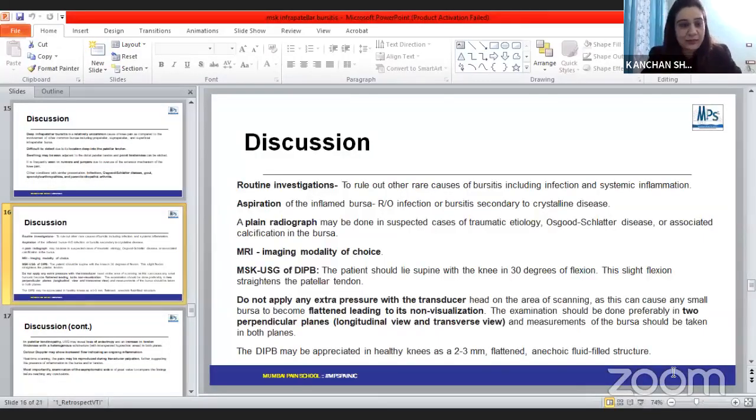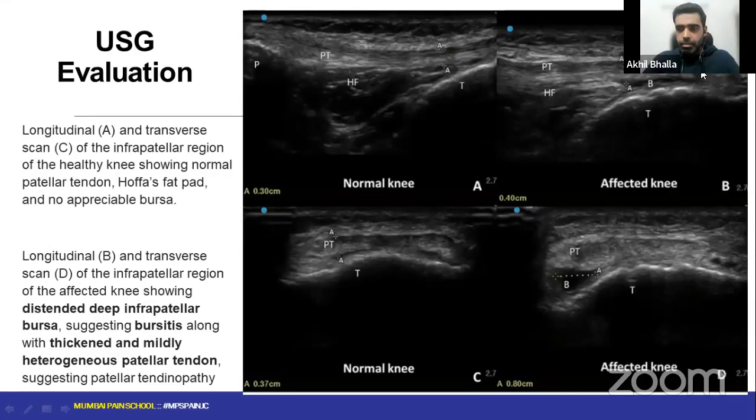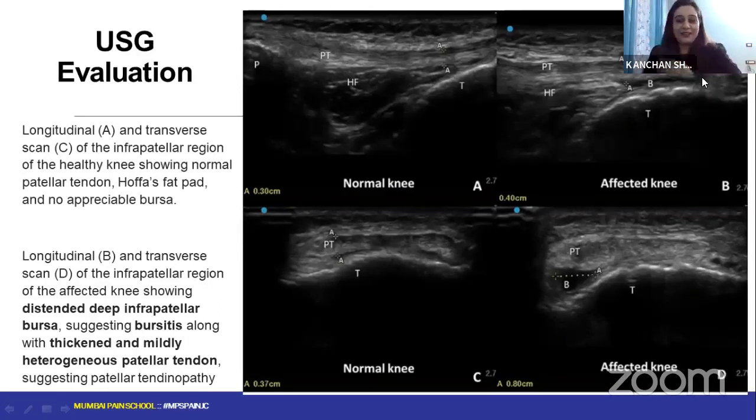Can you please show that picture once again? Because this injury, I was, yes. See, can you see it here where it is getting inserted on the tibial tuberosity? Okay, this one. Come a little more, yes. Okay. So it is like something which is going like this, but somehow I'm not very happy with the scan, because they should have taken this patellar tendon. We should not stop the moment we see the tibia coming up. We should follow it till the tibial tuberosity.